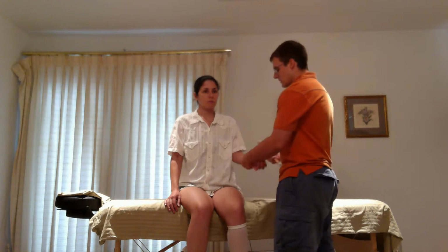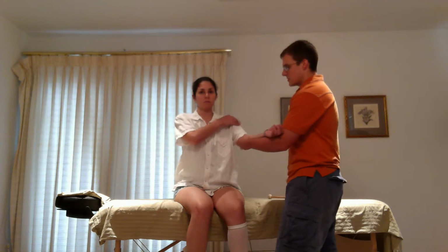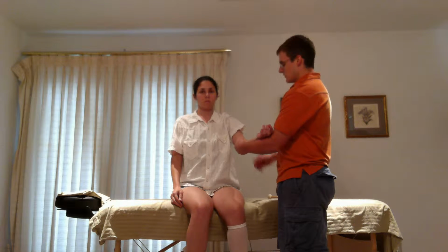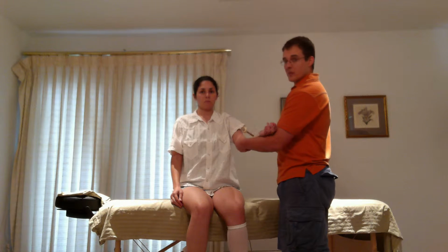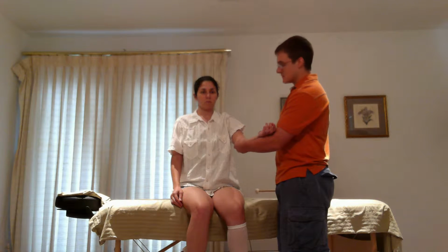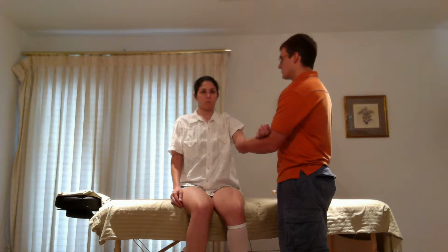You want to use a reflex hammer, but I have a mallet that I'm going to be using today because I don't have a reflex hammer. So for the biceps, you're going to be having the patient relax their arm. You're going to be tapping on your thumb, which is going to be placed on the distal portion of the biceps tendon. Okay, just relax.